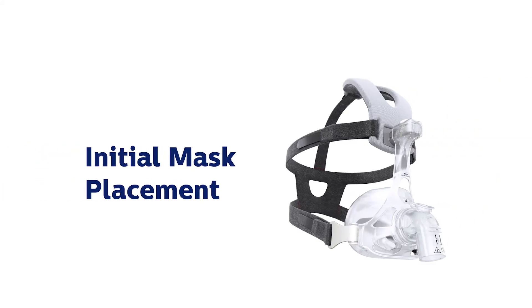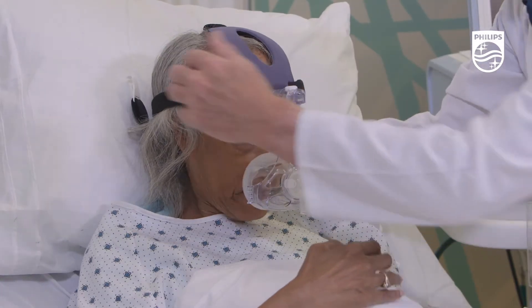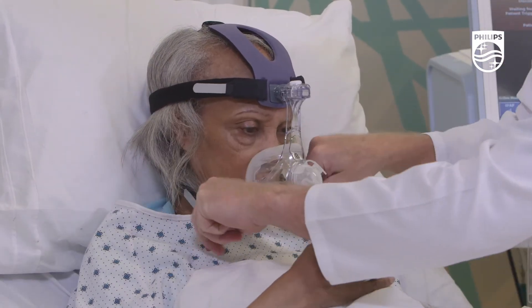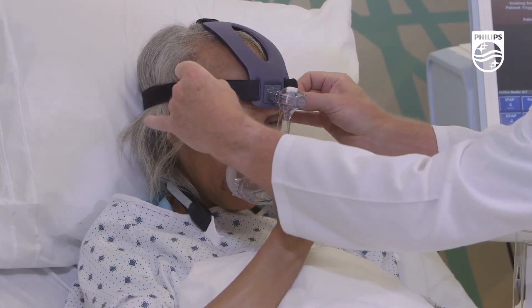After you have sized the patient, make sure the desired cushion is assembled to the headgear. Now take the mask and headgear and place it over the patient's head. Then secure the top headgear straps by adjusting both straps simultaneously.